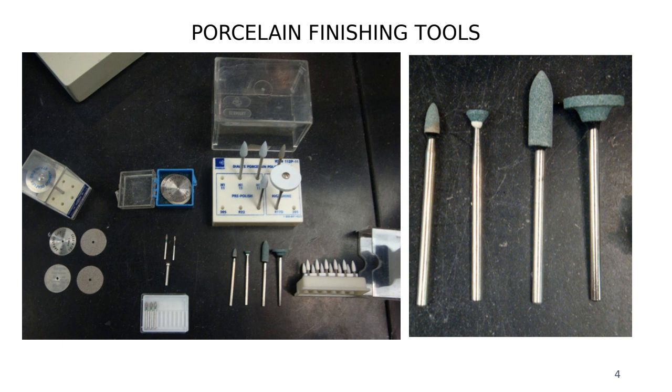I'm talking about ceramics, right? And then you use what? You use the greenstone to bulk reduce that area, and then to reshape it. So now I have to reshape that curvature of the cusp, the cusp tips, the incline plane, the line angle, right? What can I use for that?